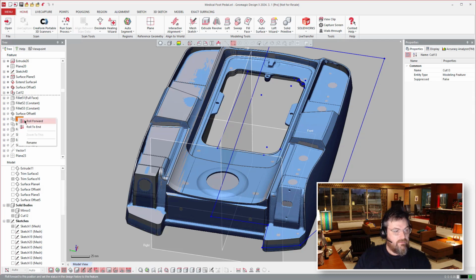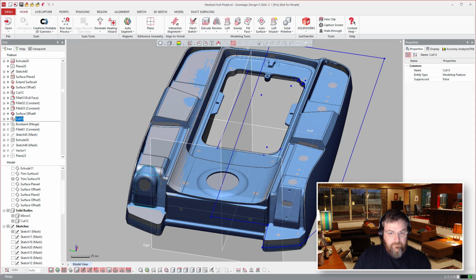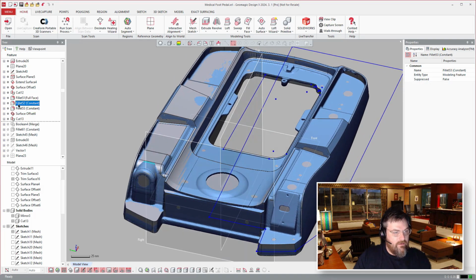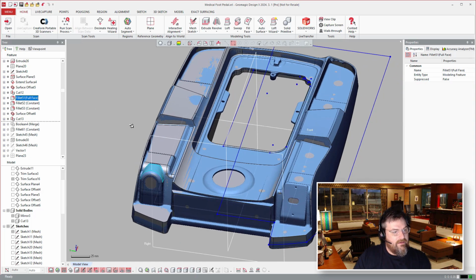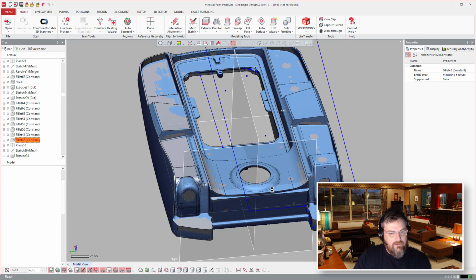And we'll add some details by adding some fillets there. So you can see if I click on the fillet over here in the tree, like we've been doing this whole time, you can see it'll highlight where that was applied. So now we'll just jump forward. And we should be close to finishing this side. We'll see here in a second. And then we'll check out the next side, the opposite side there.